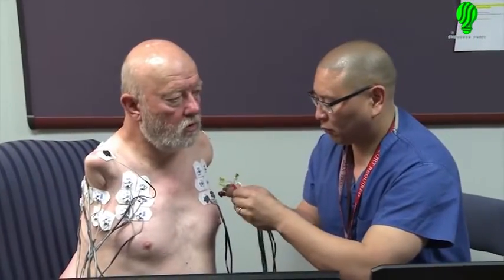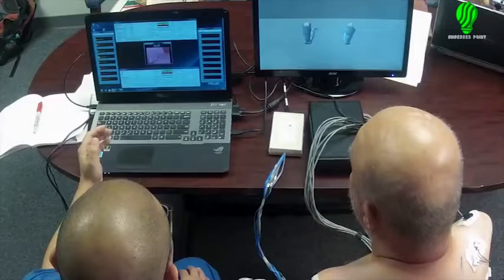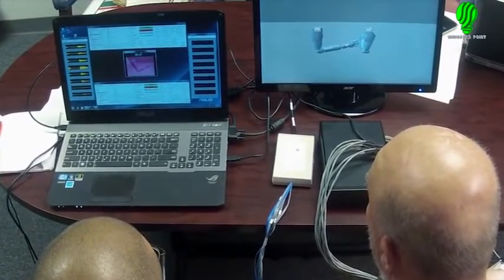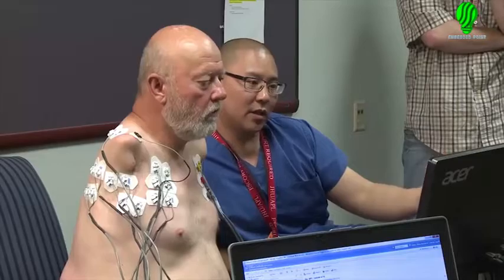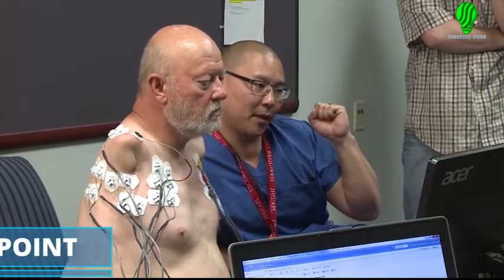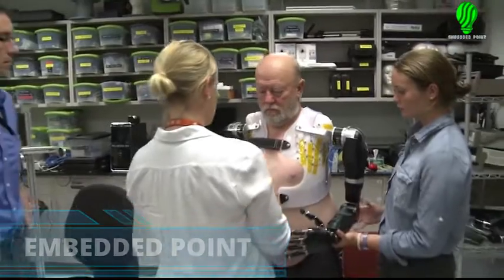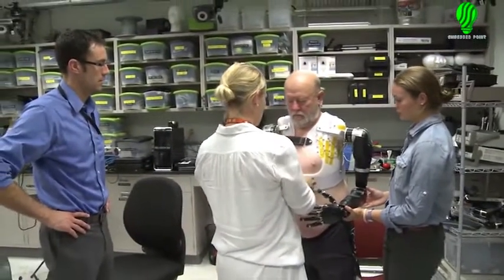While the socket got its finishing touches, the team took the next step and had Les work with the virtual reality system that mimics the actual prosthetic arms. A couple days later, the socket was back, and the arms were attached.